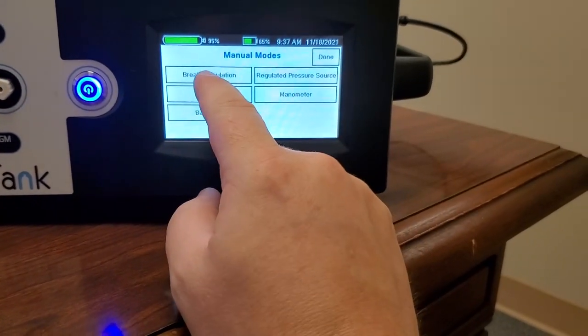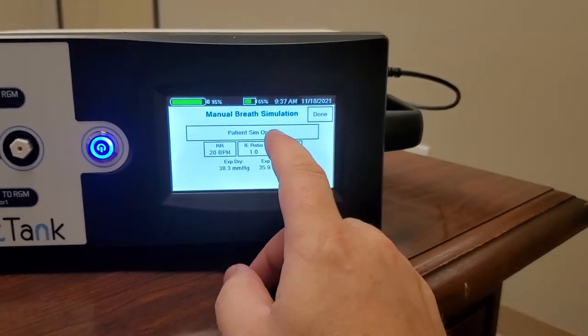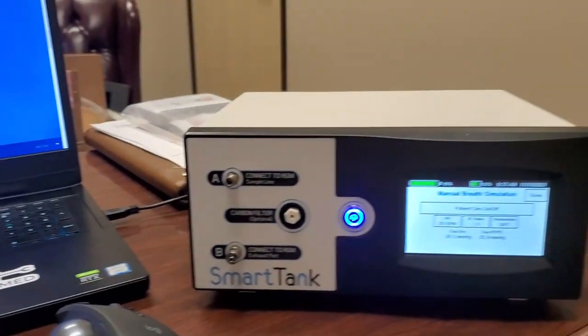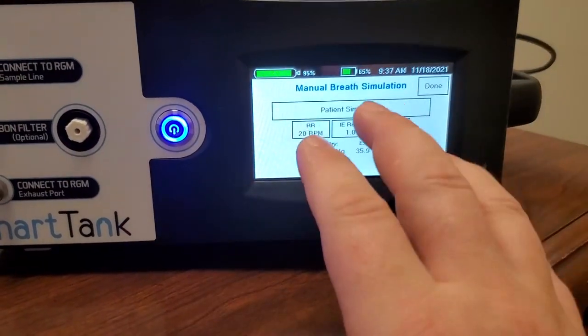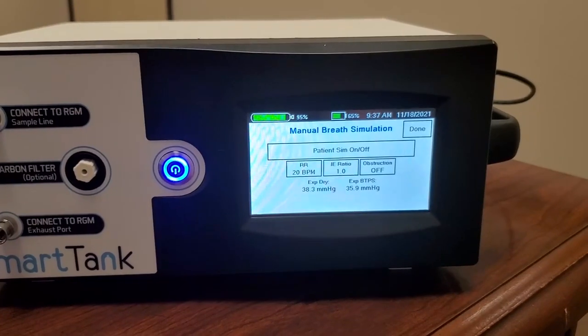Breath simulation was one of my favorite things. It basically creates the waveform on your capnography module — that's a simple function check. If you really want to check it quickly, just put on breath simulation and check your numbers.